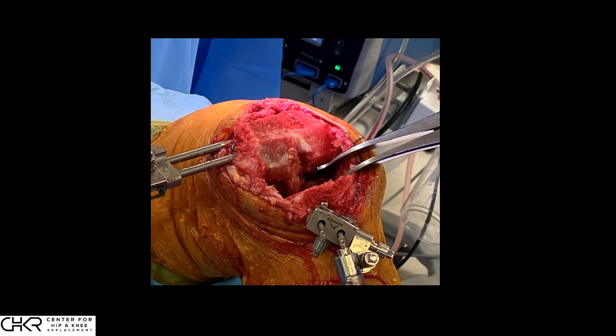In surgery, we can see the cut surface of the tibia, the cut surface of the femur, and the cruciate ligament. With a laminar spreader placed between them, we can see a symmetric gap between the medial and lateral sides. We will then confirm in the next step that we have released the right amount without losing posterior stability and translation.